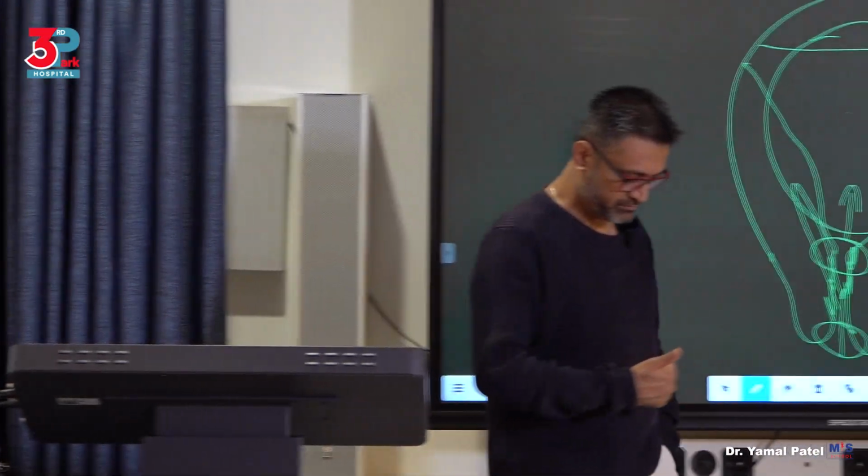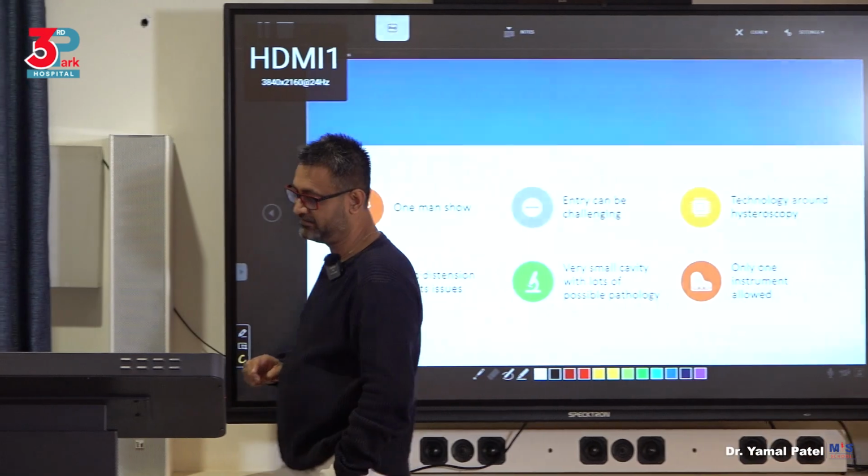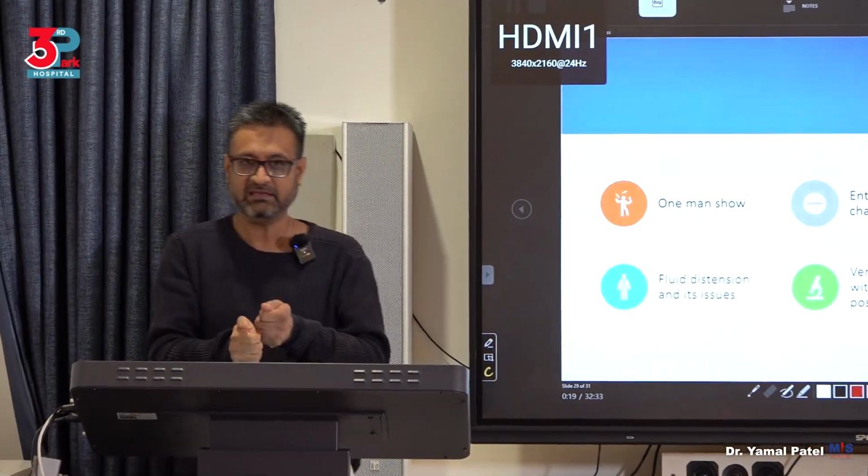So what do you need to understand about hysteroscopy? Number one, hysteroscopy is a one-man show. Okay? What does that mean? In hysteroscopy, my dear, the surgeon is the one who is holding the camera and operating. There is no assistant helping him.